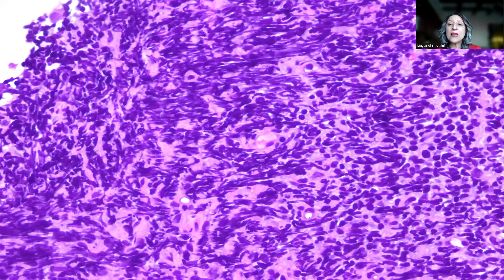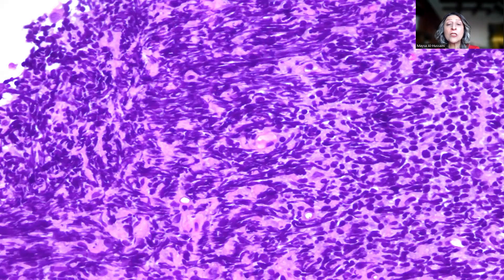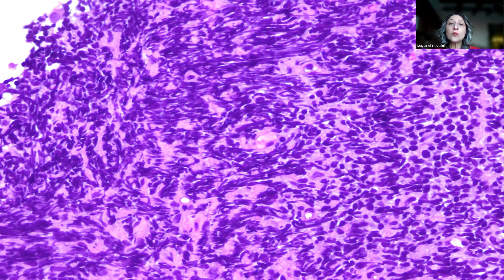On higher power magnification, you cannot really see the details of the lymphoid cells, but what you can see is the crushing. This might be tempting, especially for junior pathologists, to just ignore it because it's a crushing artifact. We know that lymphoid follicles are common in the stomach, but always be careful with the crushing artifact in lymphoid follicles.